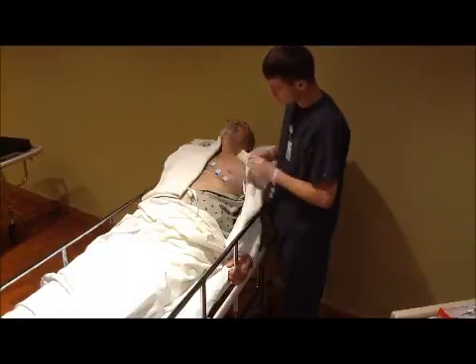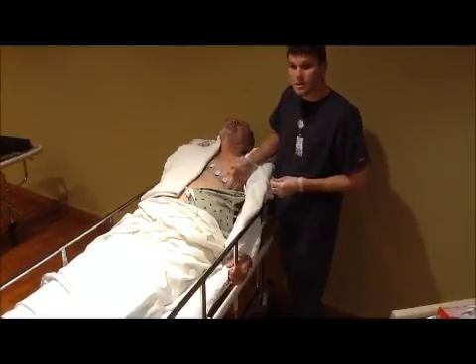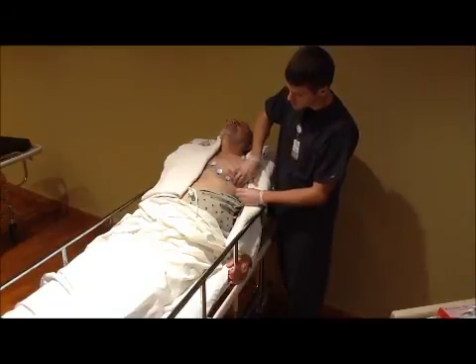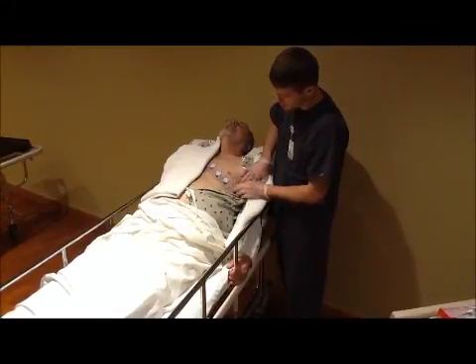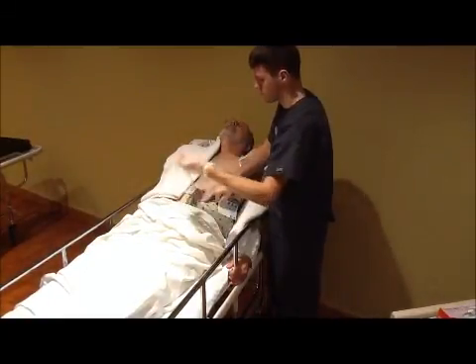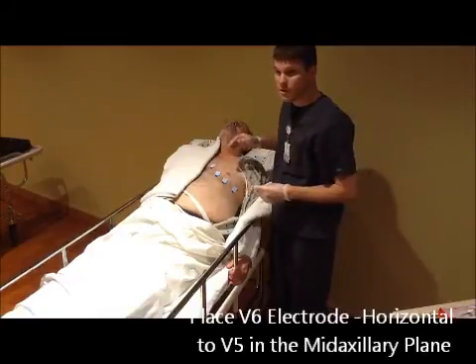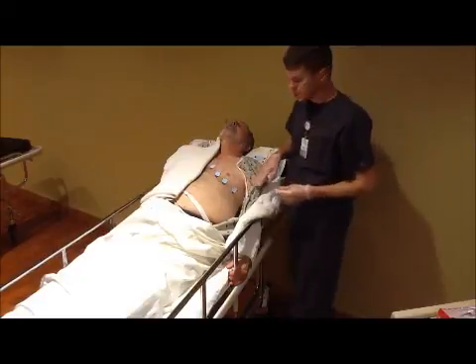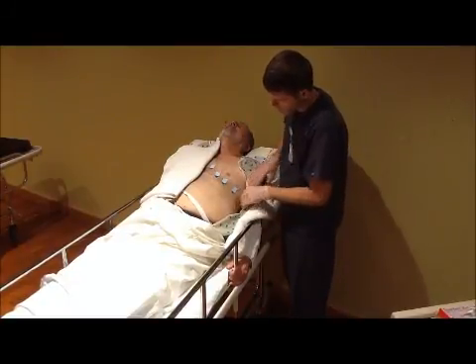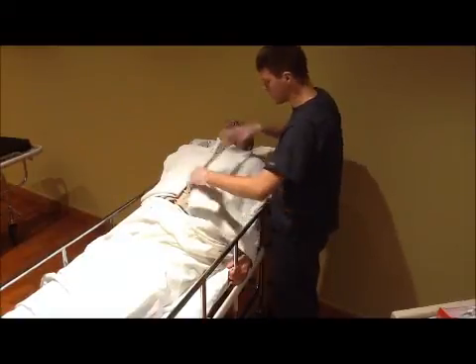Once V1, V2, V3, and V4 are placed, place V5, which is just horizontal from V4, still in the fifth intercostal space, at the beginning of the axillary curve on the body. Then the last chest electrode, V6, is lateral from V5 along the axillary line. After completing all six chest electrodes — V1, V2, V3, V4, V5, and V6 — go ahead and cover them up.